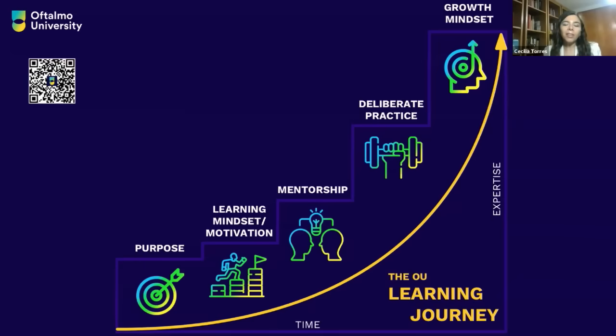We used to practice rhexis in the wrapping plastic of the package of the IOLs. You practice 1, 2, 10 times till you feel it. And then you go step by step till you get to the human eye. But it's your eyes, it's your kinesthetic abilities, and then every step done once and many times till you get to do it properly.